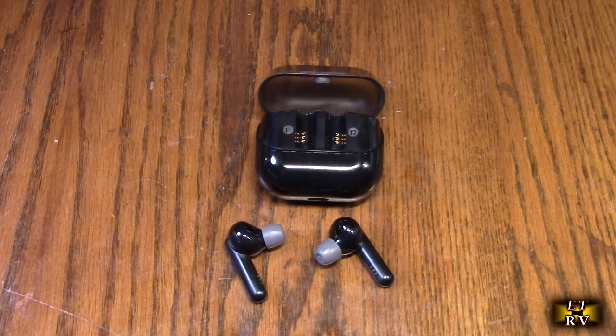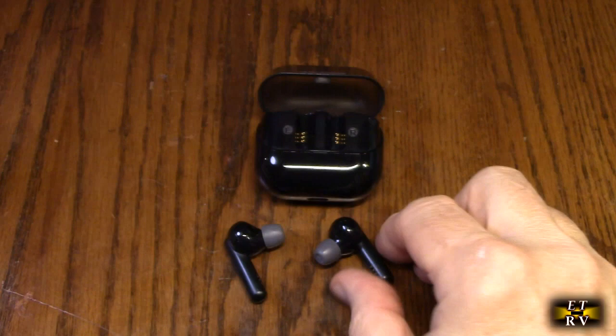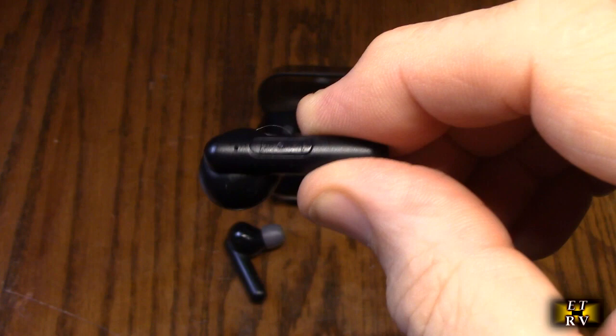The manual describes four different hearing programs. You get beeps to indicate which mode you're in: one beep, two beeps, three beeps, four beeps. To switch modes, you press and hold the plus button for about three seconds. The hearing aid beeps to let you know you've entered a different mode. You can switch between these different modes depending on the environment you're in.